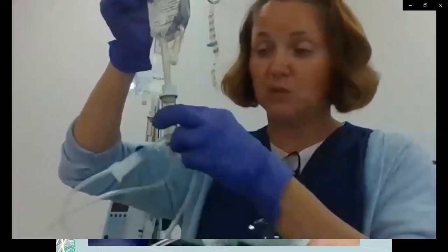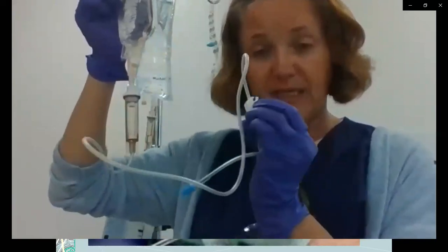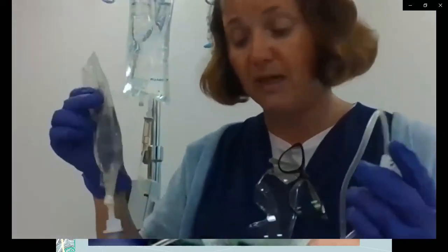Could I prime this the same way I did the primary line? Squeeze some fluid into the drip chamber and then run it out till I don't see any air. I could, but what's going to happen is whenever you run out fluid to clear it like you do your primary line, you lose some fluid because you're running those bubbles out. So you're going to lose some volume.